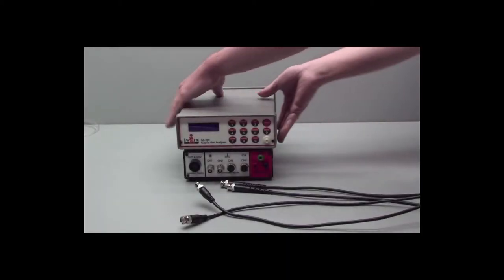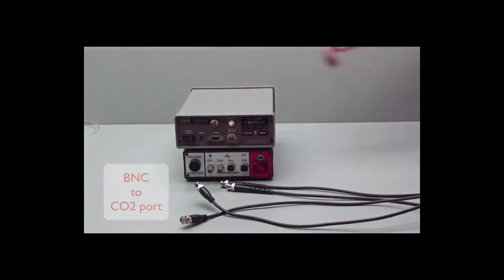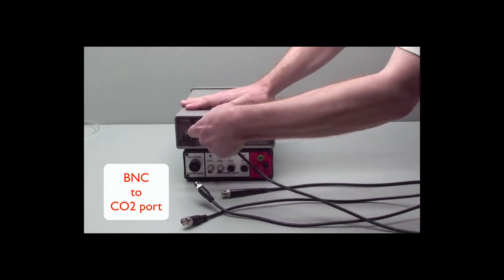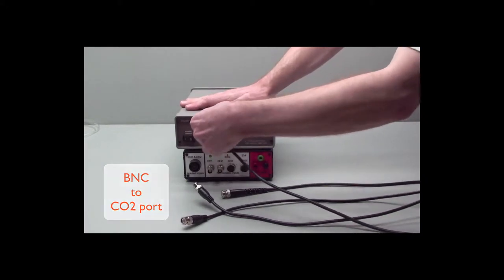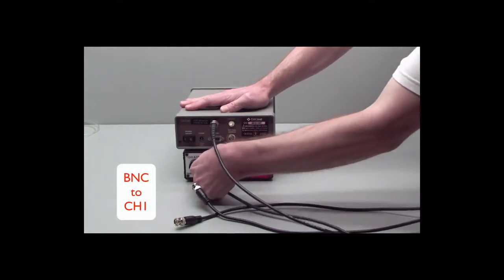To set up your components, go to the back side of the gas analyzer, and with the supplied BNC to BNC cables, take one BNC to your CO2 port, and the other end goes to channel 1 of the iWorks 214.